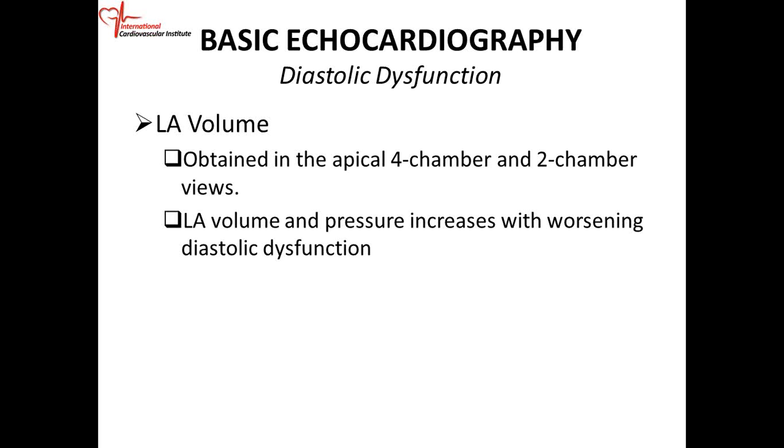To measure the left atrial volume, we're just going to go over this real quick. I'm not going to spend a lot of time on it, but it's customary when we measure the left atrium, if you remember, in the parasternal long axis, we just measure linear, from one wall to the next wall. If it's more than 4 centimeters, then it's enlarged.